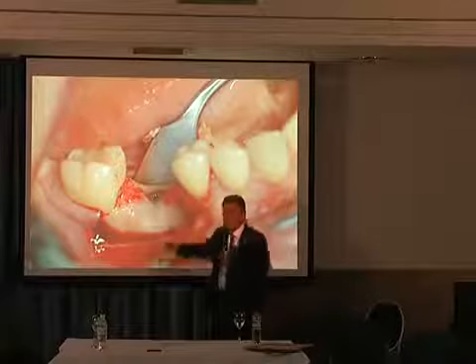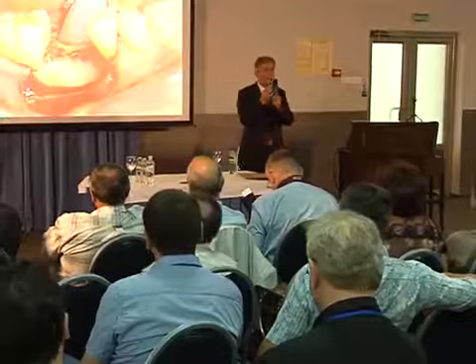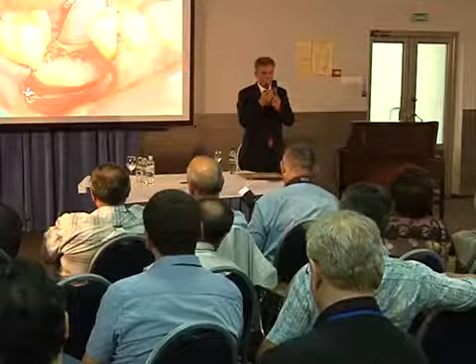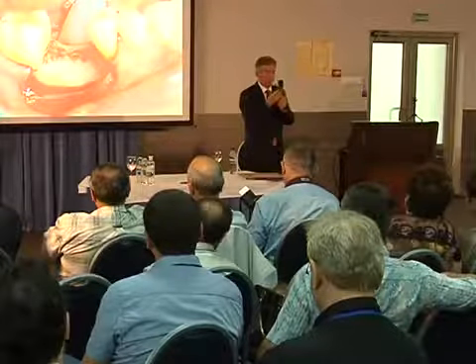Because after splitting, think about what happened with the buccal bone. We start here, and then we split. What happened vertically to the buccal blade? It's coming down.